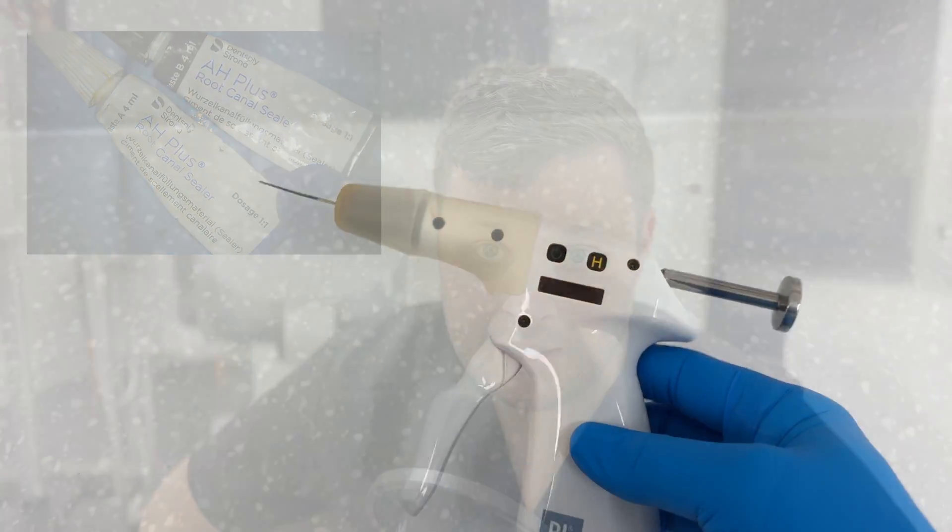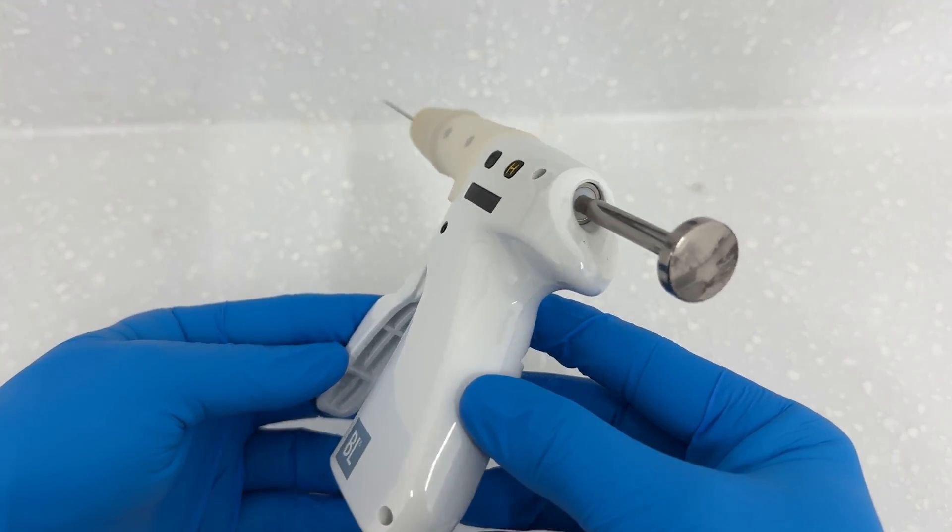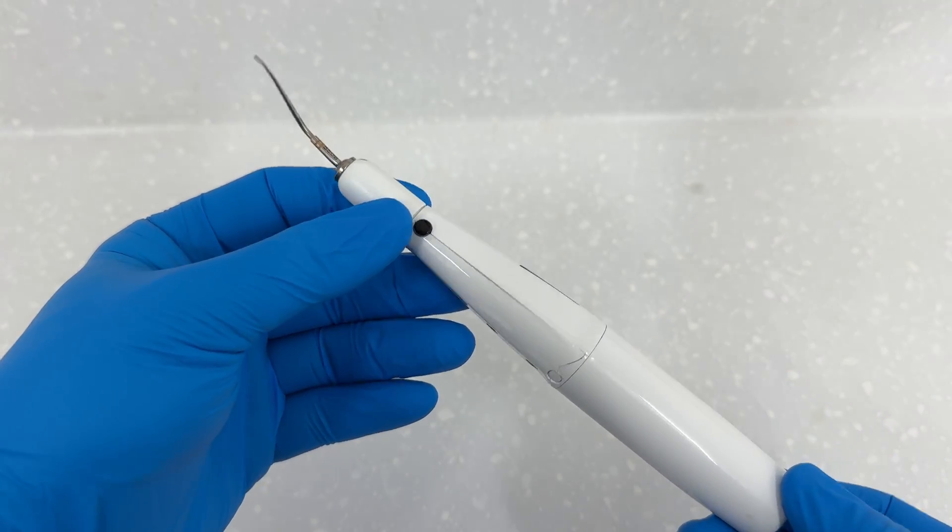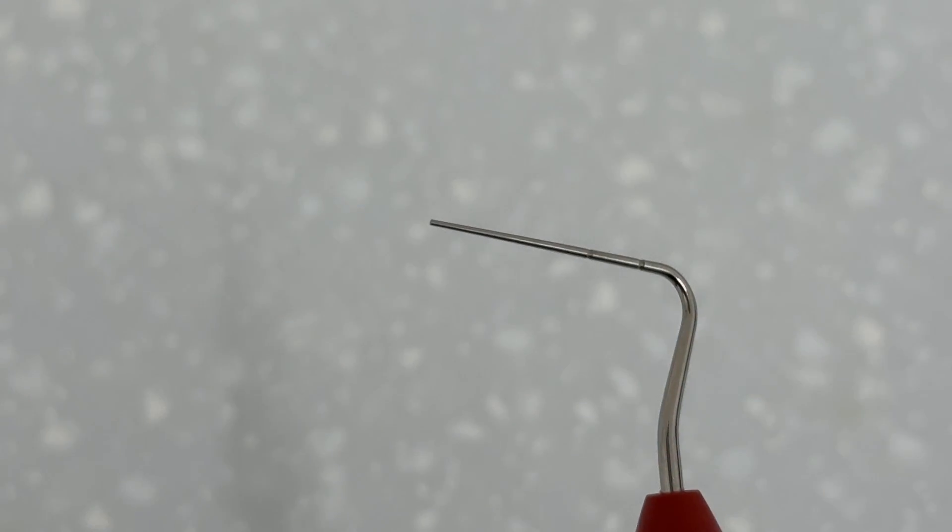The problem with warm vertical technique, of course, is it's very technique sensitive and can be a little bit difficult to get your head around. The things you're going to need: a resin-based sealer — you can't use bioceramic in this case because a resin-based sealer can be used with heat. You're going to need a backfill unit to deliver warm gutta-percha to the canal, a heated plugger, and ideally some Mach 2 pluggers as well.